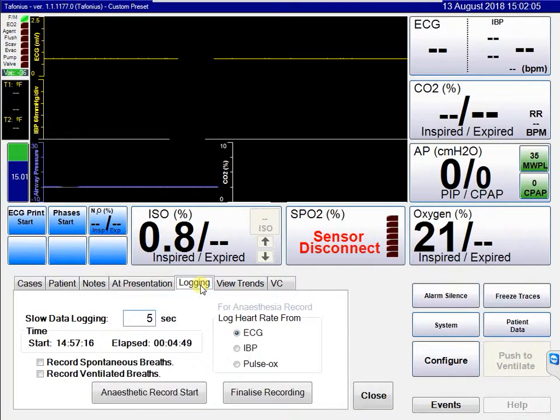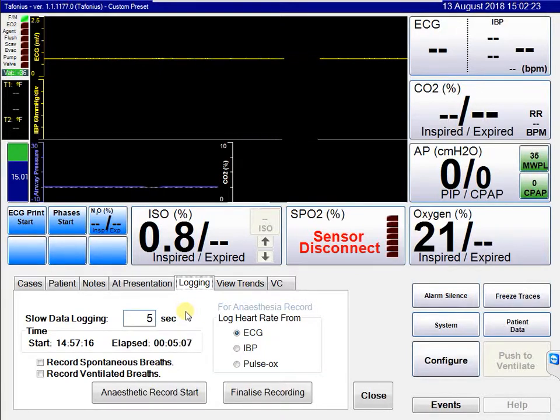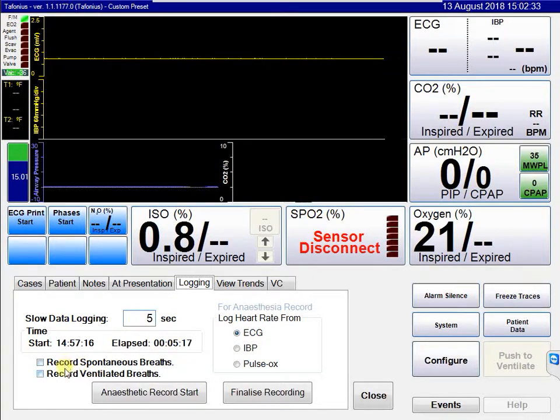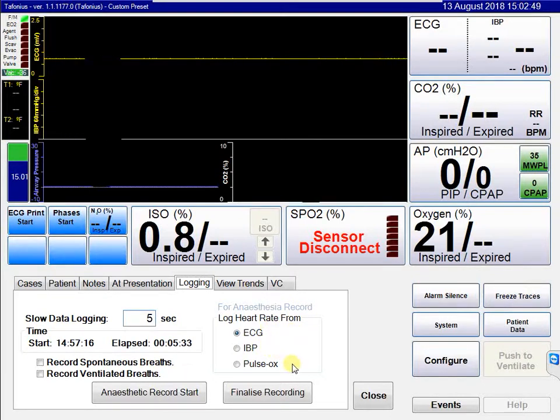The logging screen shows that slow data logging is set to every five seconds by default. This is recommended unless you have good reason to change it — either to conserve hard disk space or for research purposes requiring a faster rate. Five seconds represents a good average between file size and data collection. You may also have options to record spontaneous or ventilated breaths. For the anaesthesia record, the heart rate can be derived from ECG, IBP, or pulse oximetry; by default it is logged from the ECG.